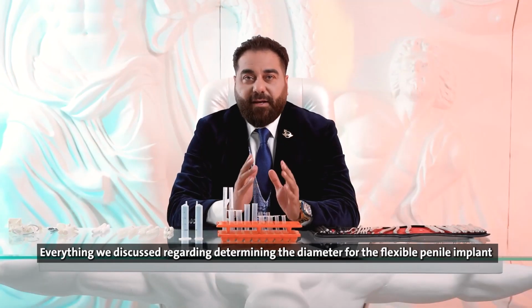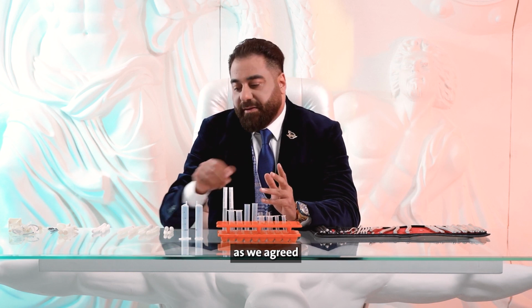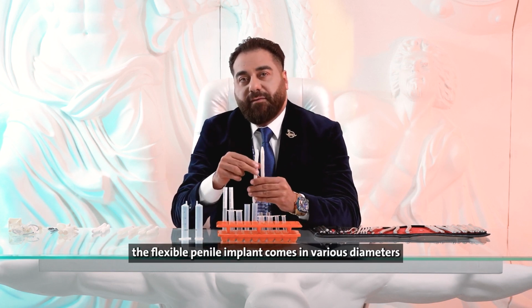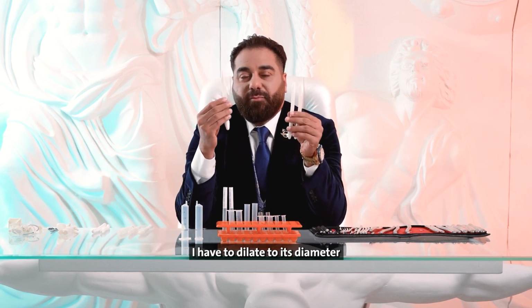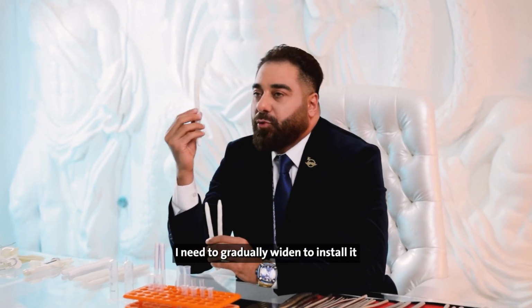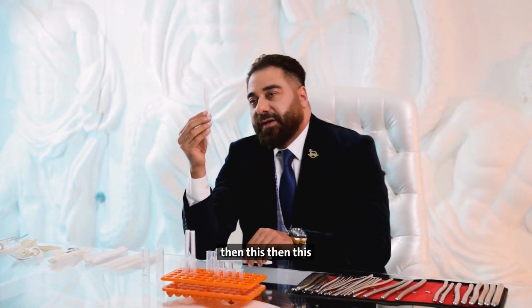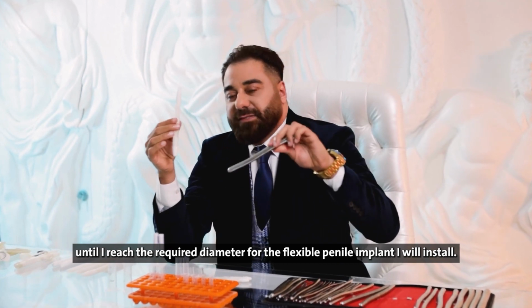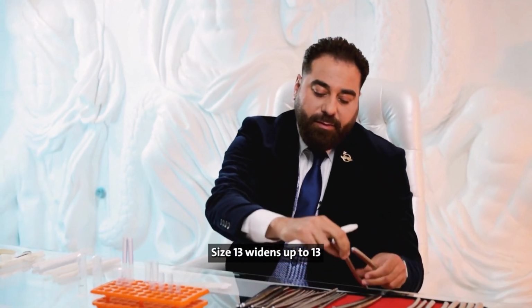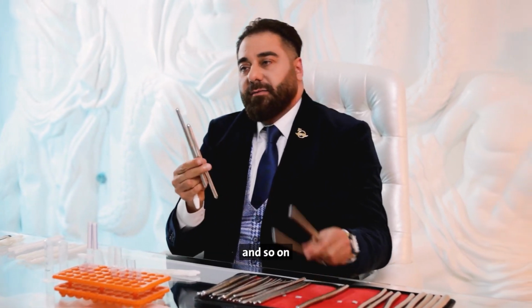Everything we discussed regarding determining the diameter for the flexible penile implant is because, as we agreed, the flexible penile implant comes in various diameters. When I install this particular penile implant, I have to dilate to its diameter. I need to gradually widen to install it. I start with this size, then this, until I reach the required diameter for the flexible penile implant I will install. Size 13 widens up to 13, size 12 widens up to 12, and so on.